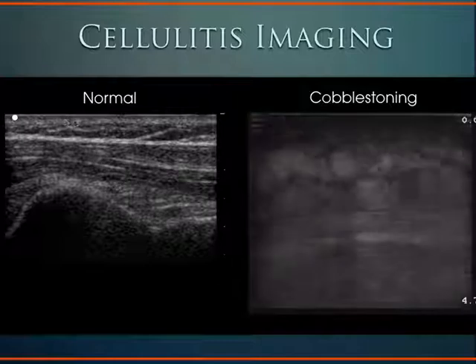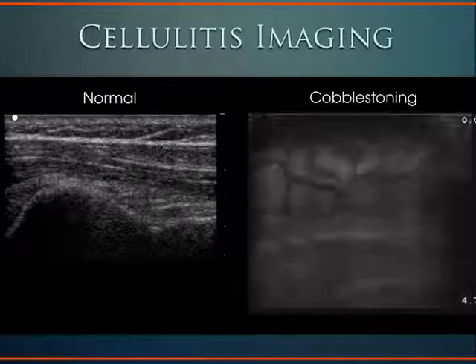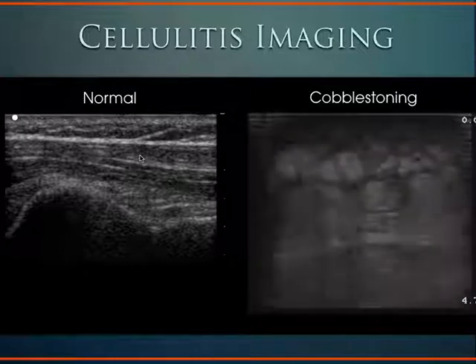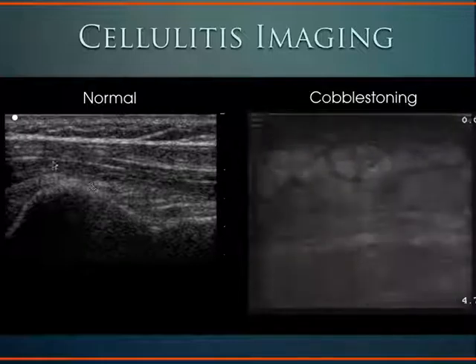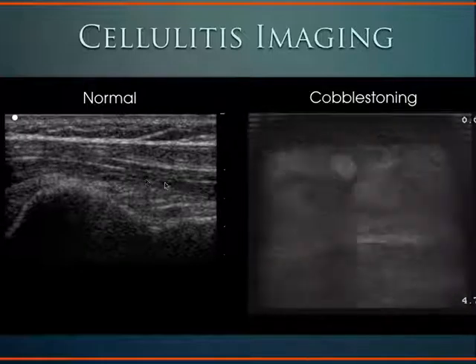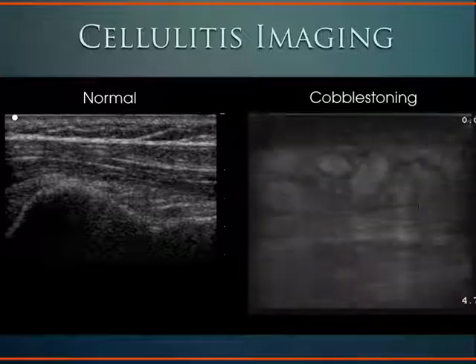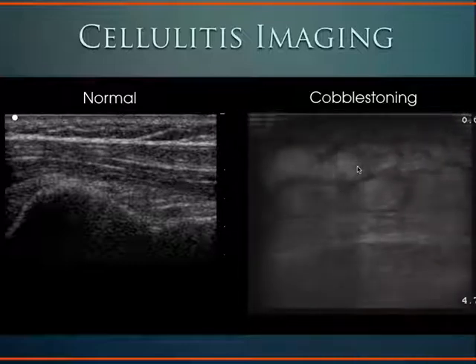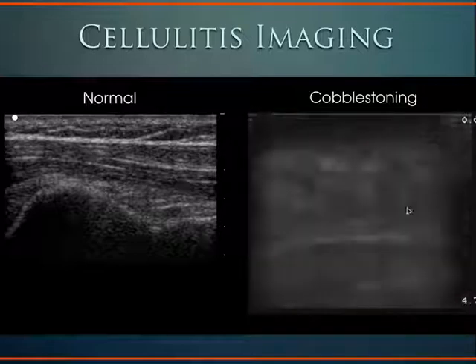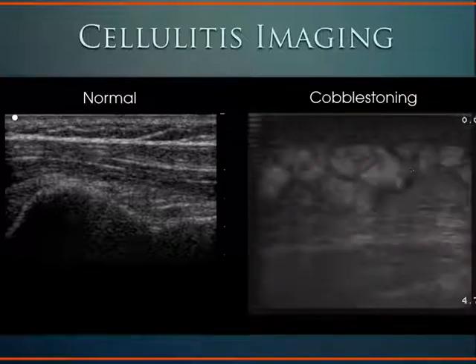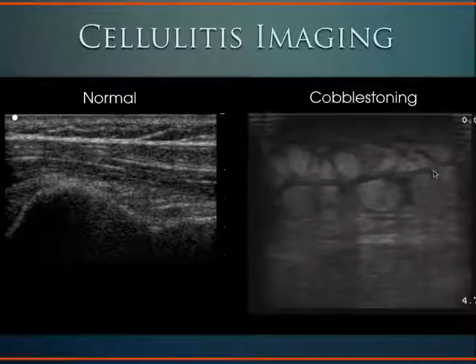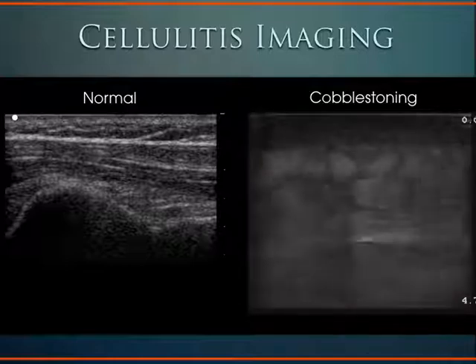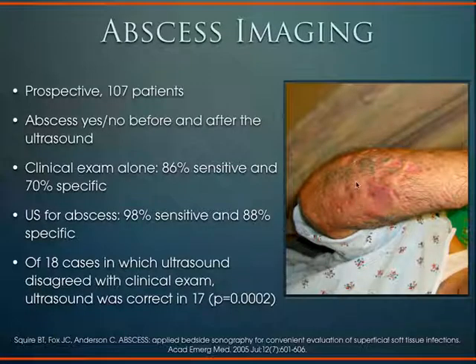Normal soft tissue looks like this — we see the skin line, subcutaneous fat, a fascial plane, more soft tissue, bony structure, and a tendon. With cellulitis, we see cobblestoning: hyperechoic regions in the subcutaneous soft tissue with some anechoic edema outlining the different cobblestones. Notice there's no abscess here.